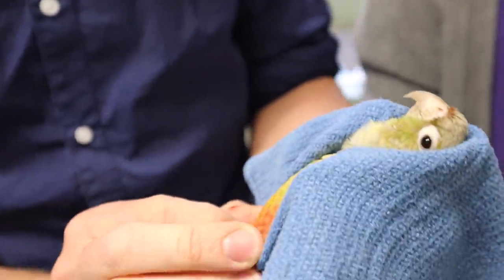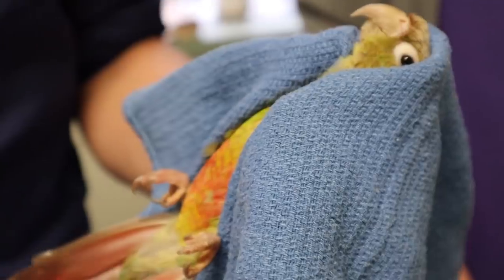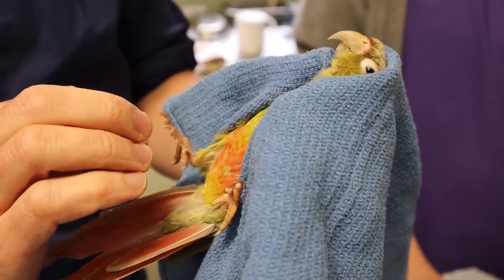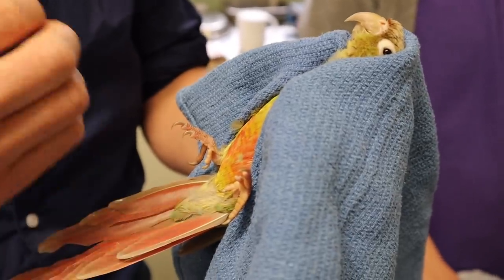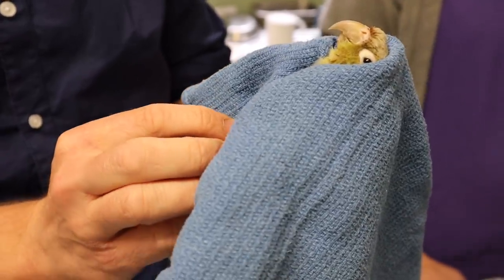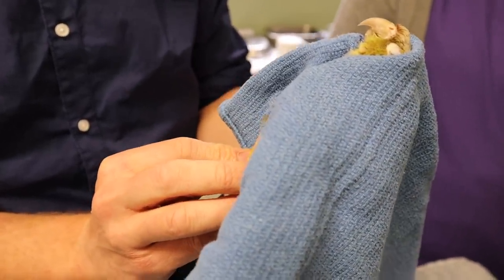For these little birds, when we microchip anything under 100 grams, I definitely offer an anaesthetic. But the microchips these days are getting so small that I can easily microchip a bird larger than 100 grams, and I find that birds tolerate it just as much as basic antibiotic injections. Even though the chip is a larger implant, the reaction is not much different from an antibiotic, so I don't believe it's worth the stress of an anaesthetic for those birds. For these little birds, I always give clients the option of a quick anaesthetic because it is still a large injection.